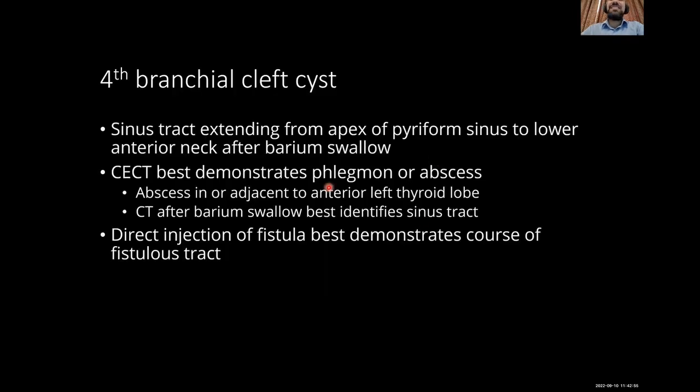Yeah, great. This is the fourth branchial cleft cyst. Okay, this cyst in that region. Where is the first type? Where is the first type? First branchial cleft cyst. Yeah, retroauricular. Yeah, great.